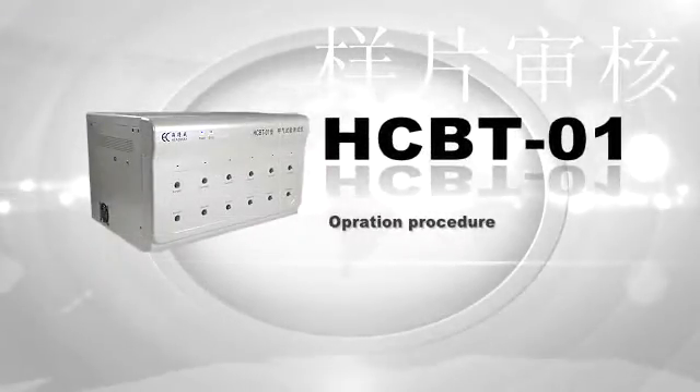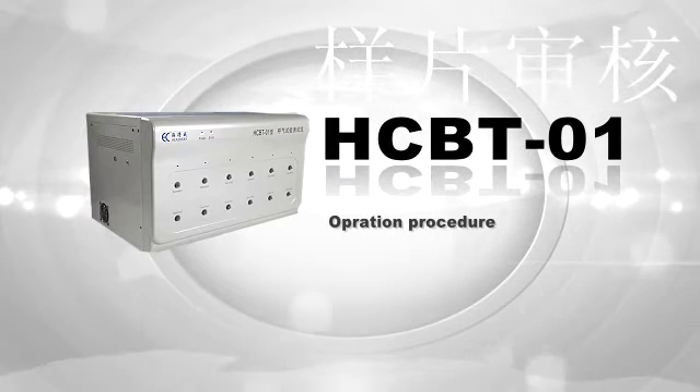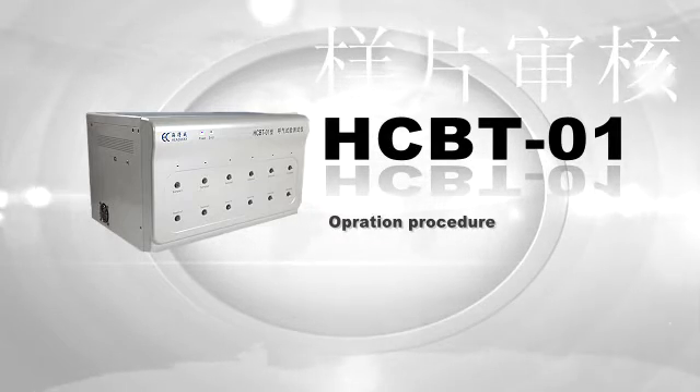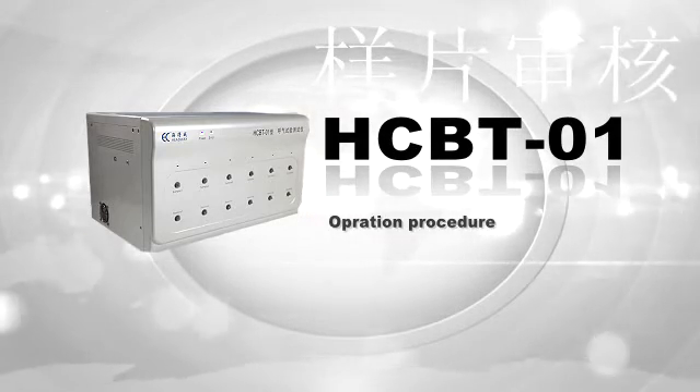Thank you for using the Headways HCBT01 Helicobacter pylori analyzer. In this video, we will introduce the functions and show you how to operate and calibrate it.